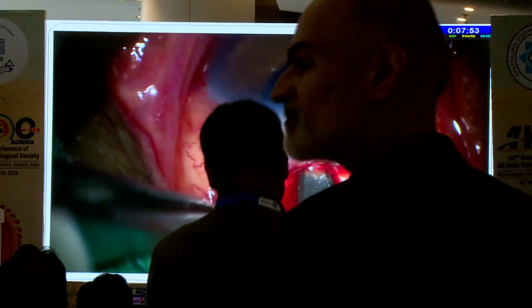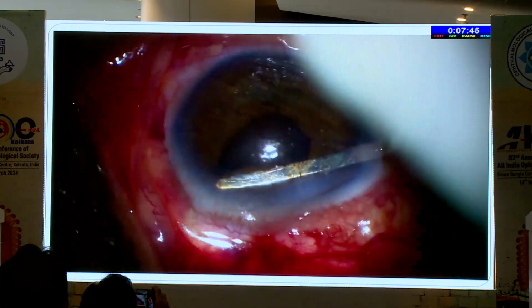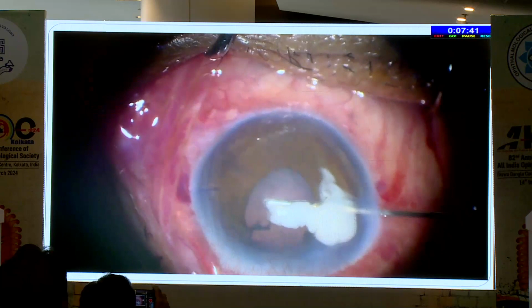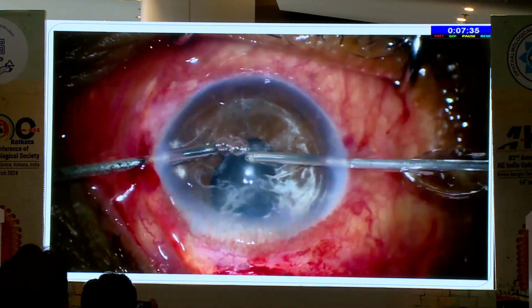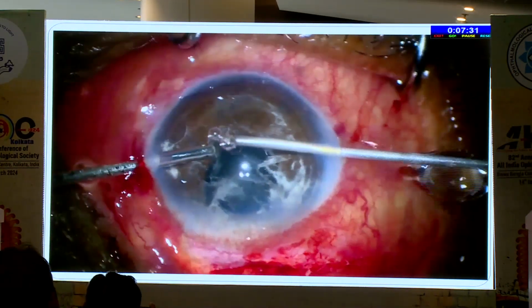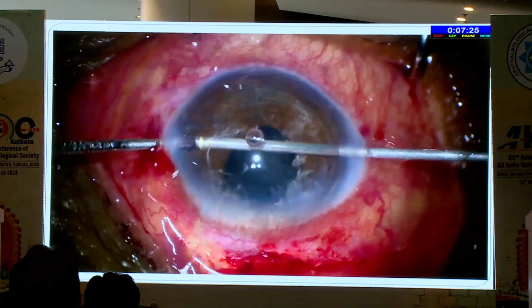This was a 4 weeks old case, so there was a scleral tunnel and also adherent iris tissue superiorly, which was released with the help of an iris repositor. We can use triamcinolone to stain the prolapsed vitreous, which helps us better visualize the anteriorly prolapsed vitreous, and the anterior vitrectomy is then performed to remove all the tractions and all the vitreous from the anterior chamber.